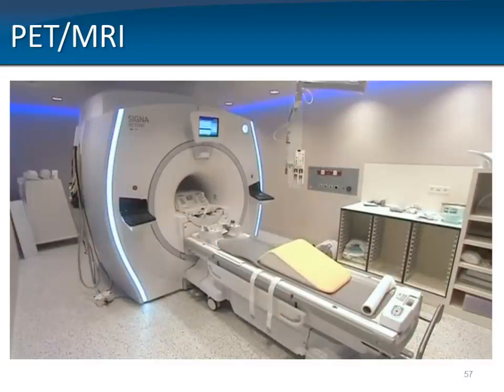I'm very happy and proud to say that only last week, we inaugurated the first PET-MR scanner in Belgium, which is, I'm also very proud to tell you, a truly collaborative effort between the various university hospitals in my part of the country, so that we could afford this very expensive new machine.